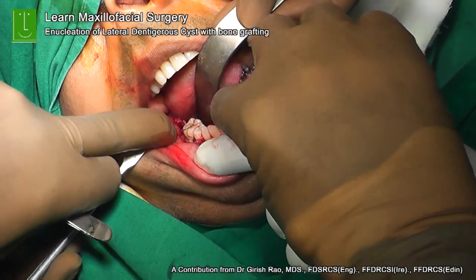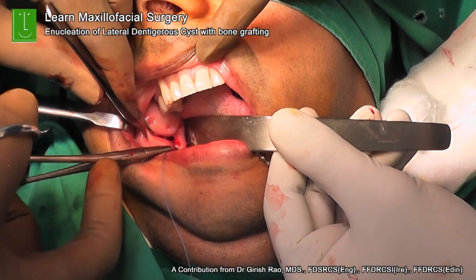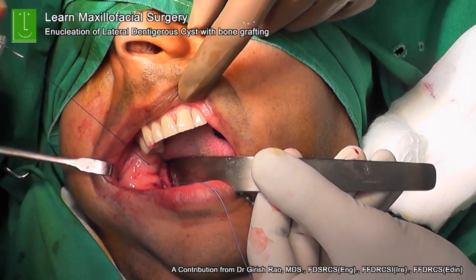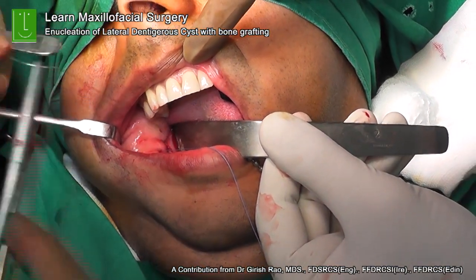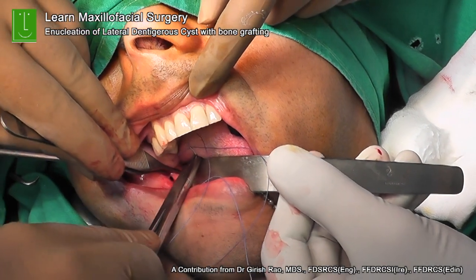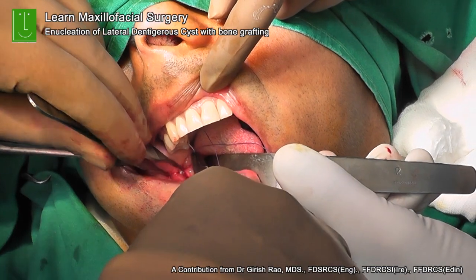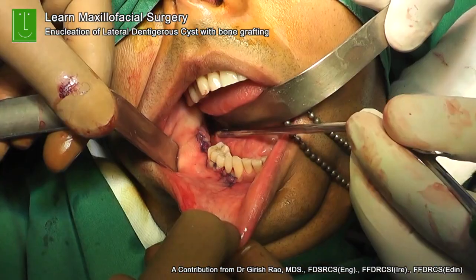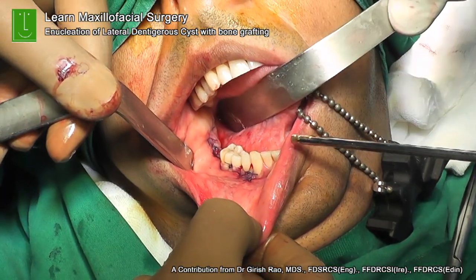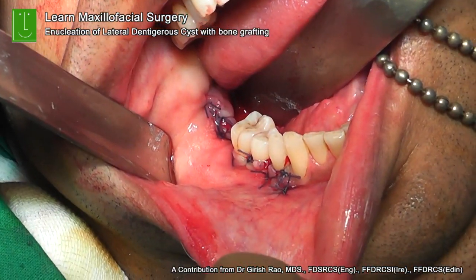That's a hand tie. Again, hand tie is very, very useful. It approximates the tissues together with very, very good, ideal pressure. And in the vertical limb, I'm putting a mattress stitch there. So it's basically a square stitch, and that basically brings the tissues together with good eversion and a watertight closure. What is the suture material I like to use? Normally intraorally I use either a 3-0 or 4-0 Vicryl. That's my favorite suture material. And that's the kind of closure which you can get.